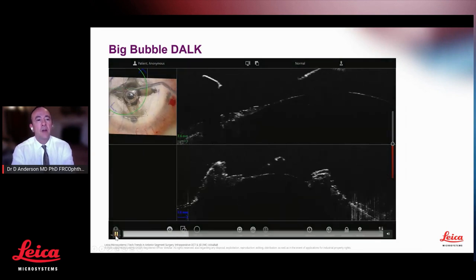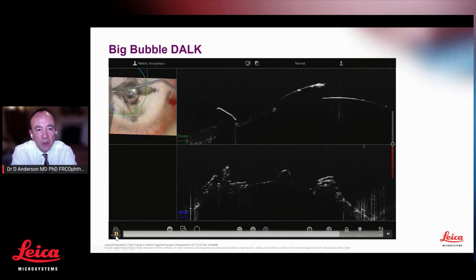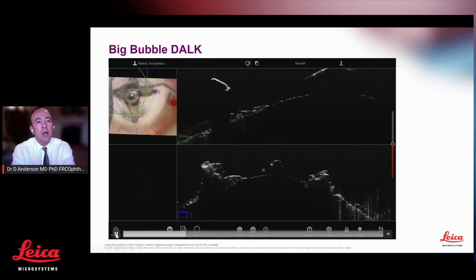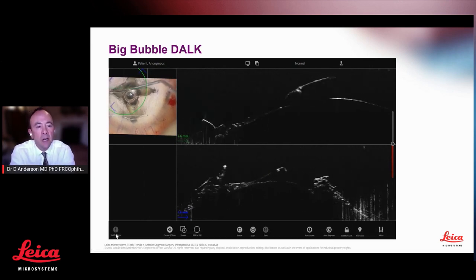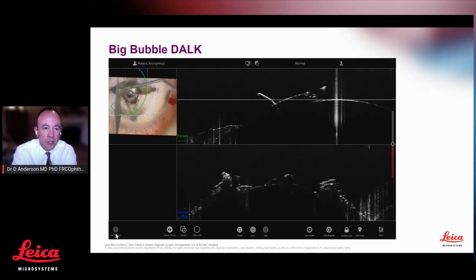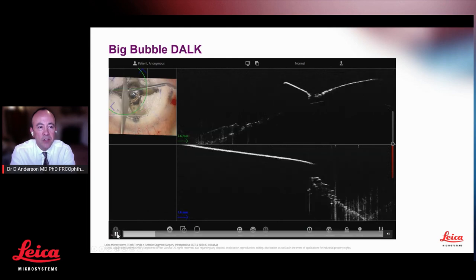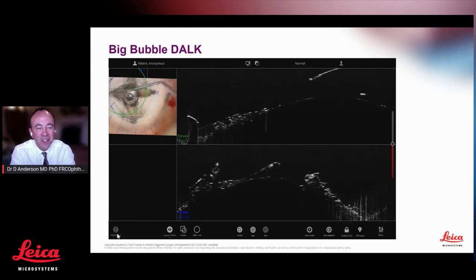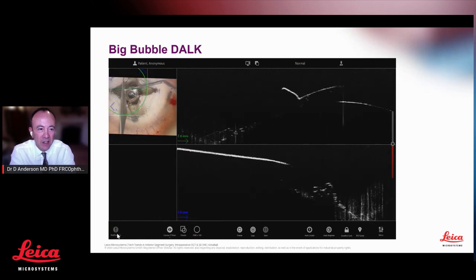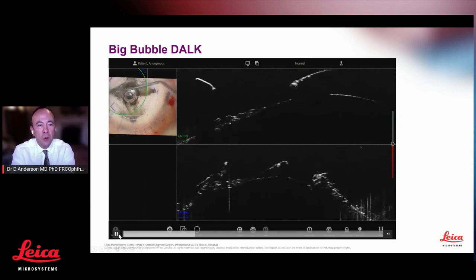Okay, here we've taken off the anterior part of the cornea, and we've got this lovely shiny surface beneath it. You can see a little bubble in the anterior chamber, and it looks like we've got a nice PDL, but I hope it's visible to you. In this particular case, we could see air between the dissector and PDL, so we knew that we were not quite on that layer.